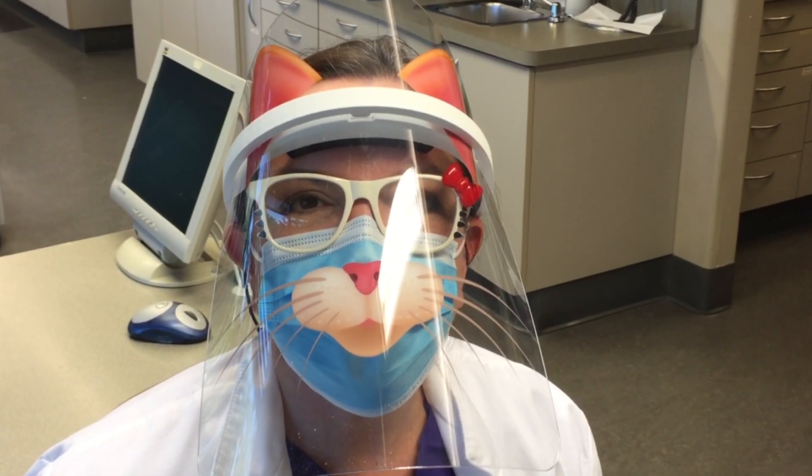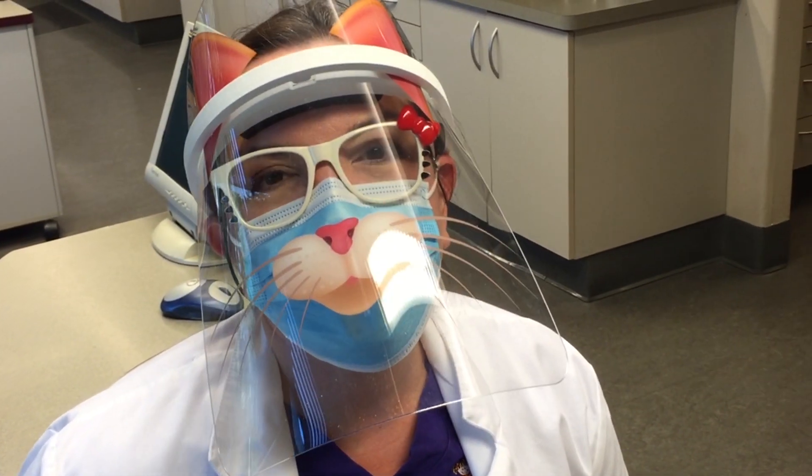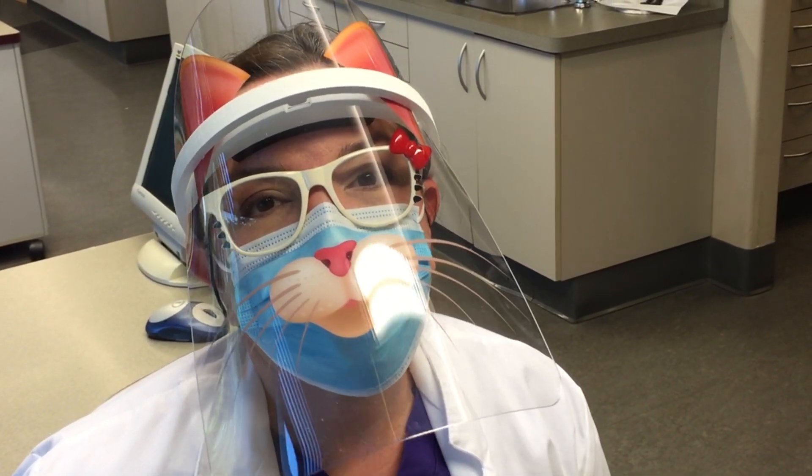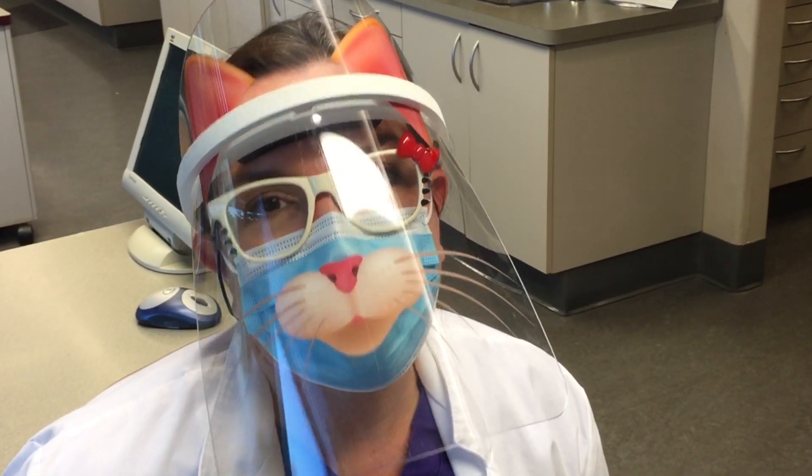Hi, Dr. McLean here. I'm going to show you how to apply silver diamine fluoride or SDF without the need of any compressed air or water syringe, so we're going to be able to do this without creating any aerosol.